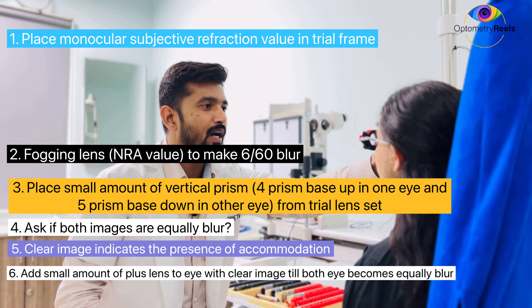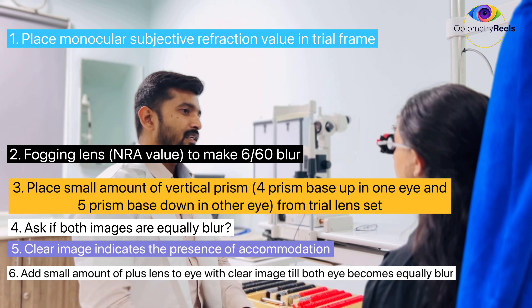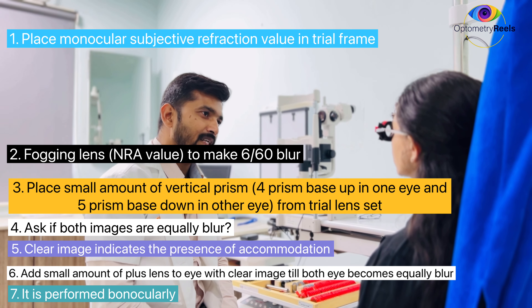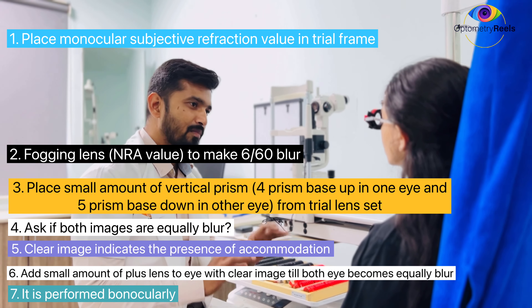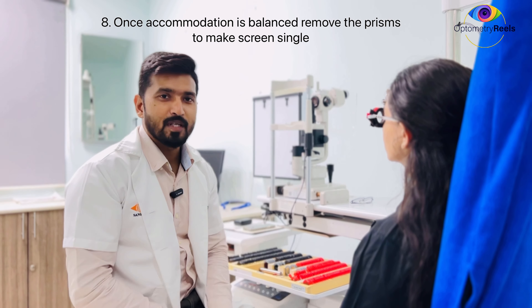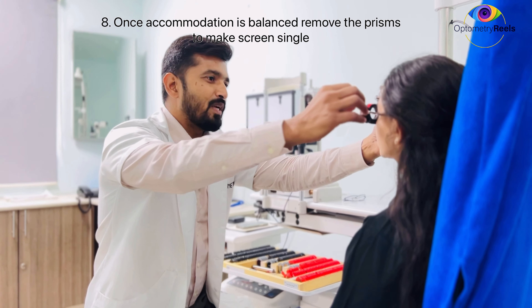So to balance the accommodation, I am going to add +0.25 in the right eye. Again, confirm whether the images in both eyes are equally blurred. Both images are equally blurred. It means we have achieved accommodation balance.